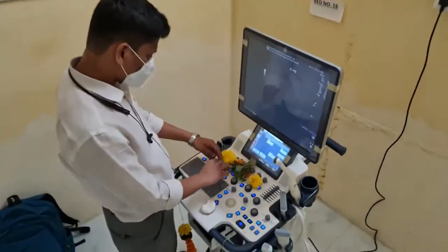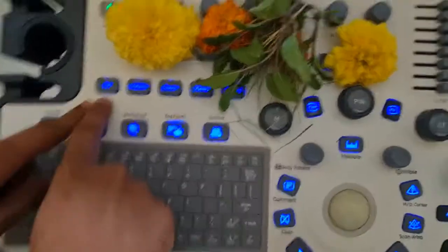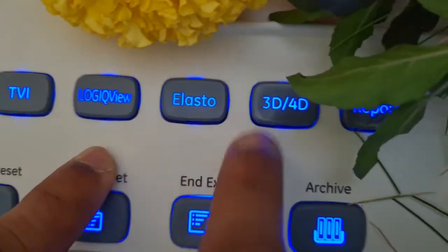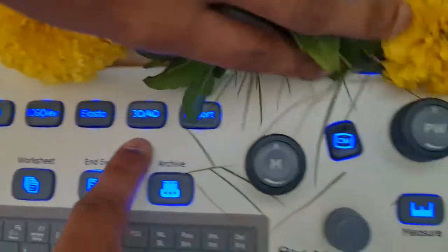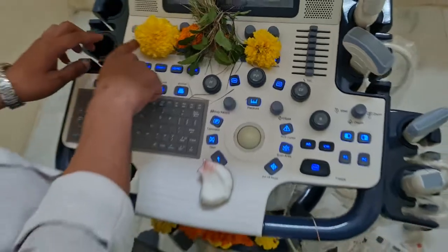After that, here are the shortcut buttons like tissue velocity imaging. This is the logic view. This is used for elastography. This is used for 3D 4D mode, and this is used for the report format. Okay. And after that, here's the power button.